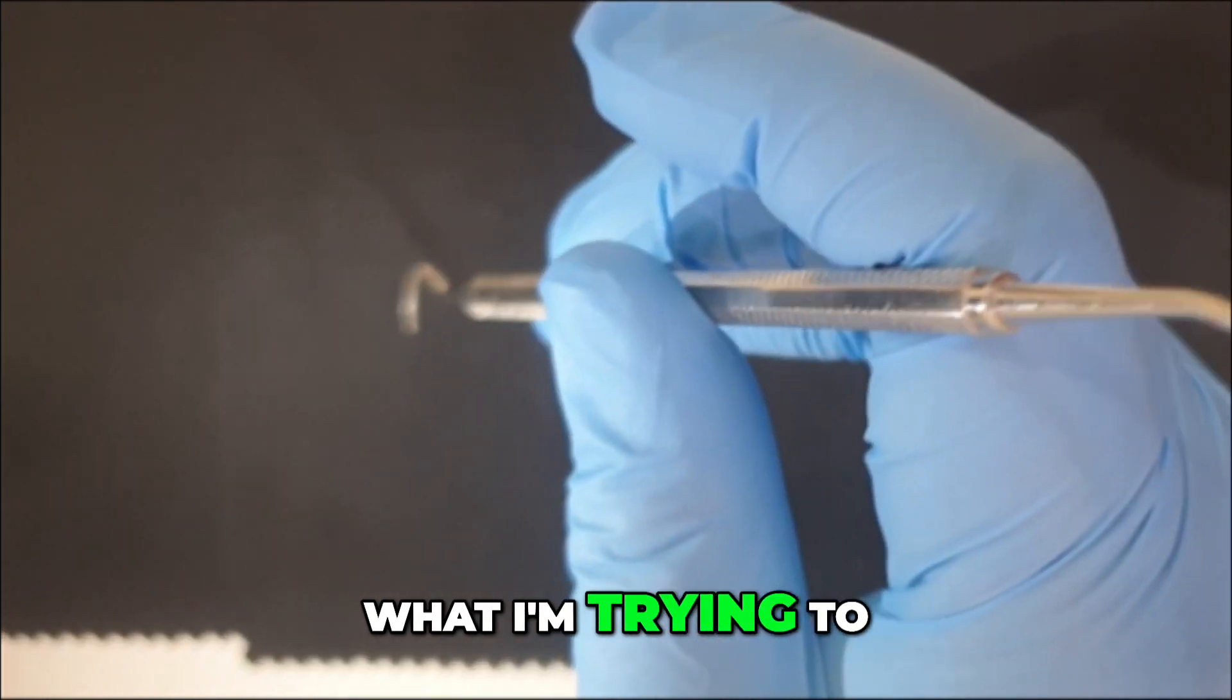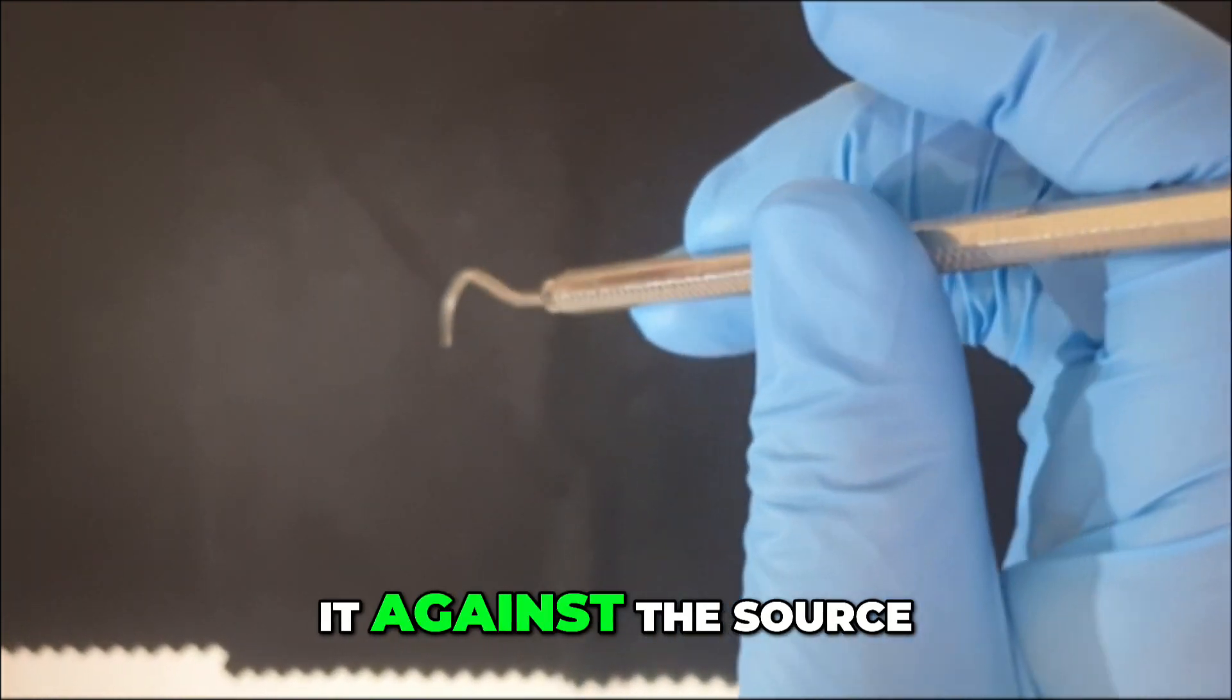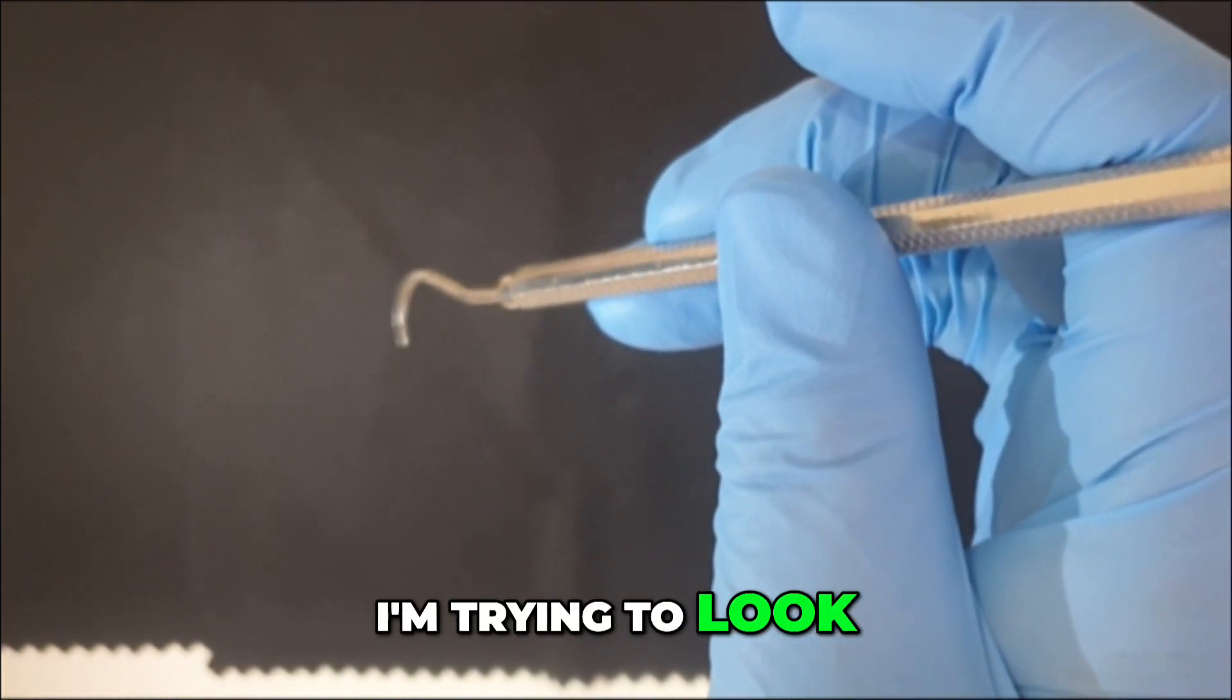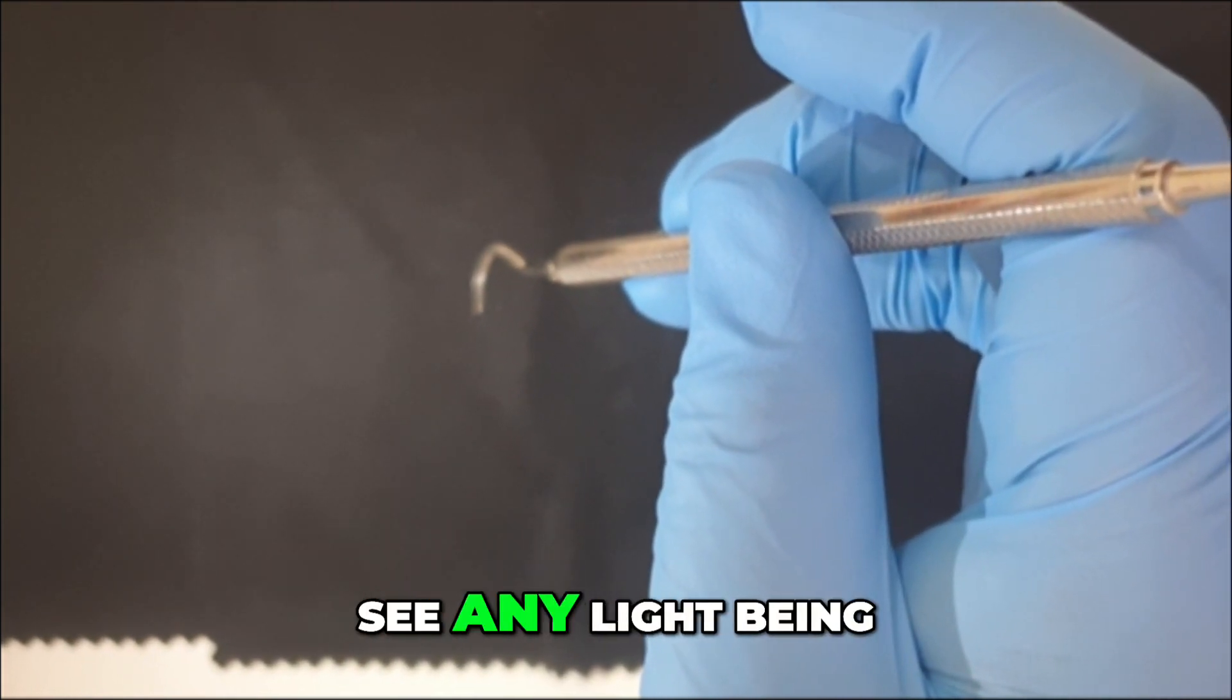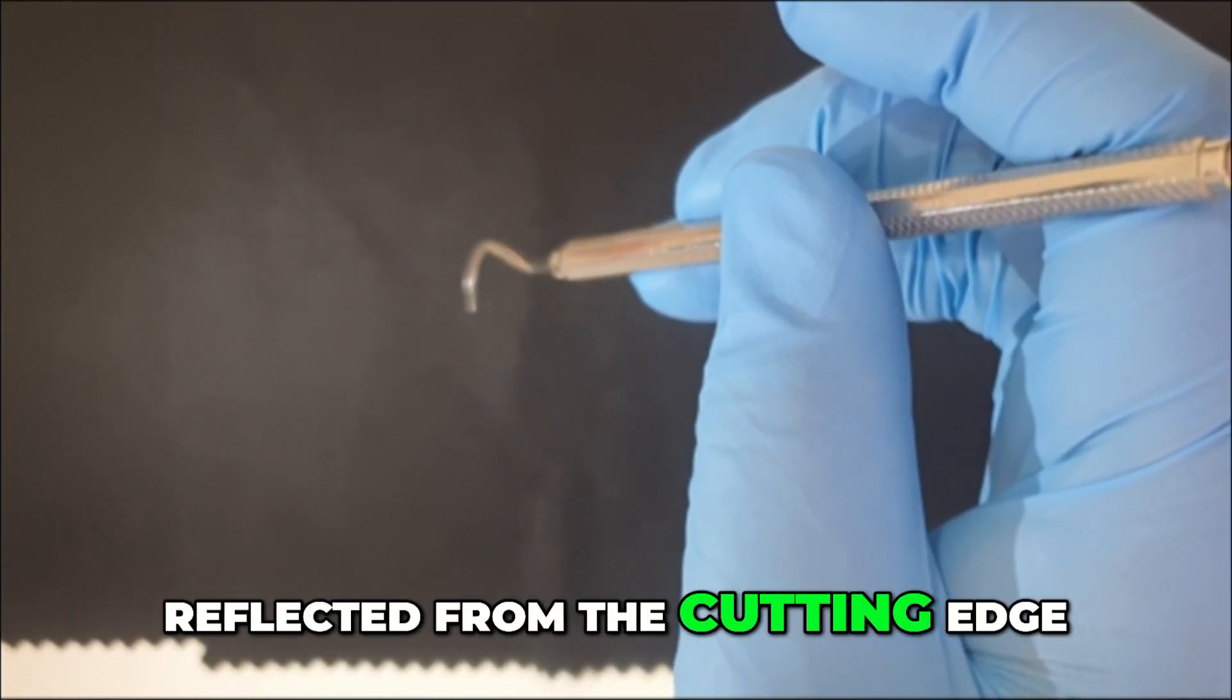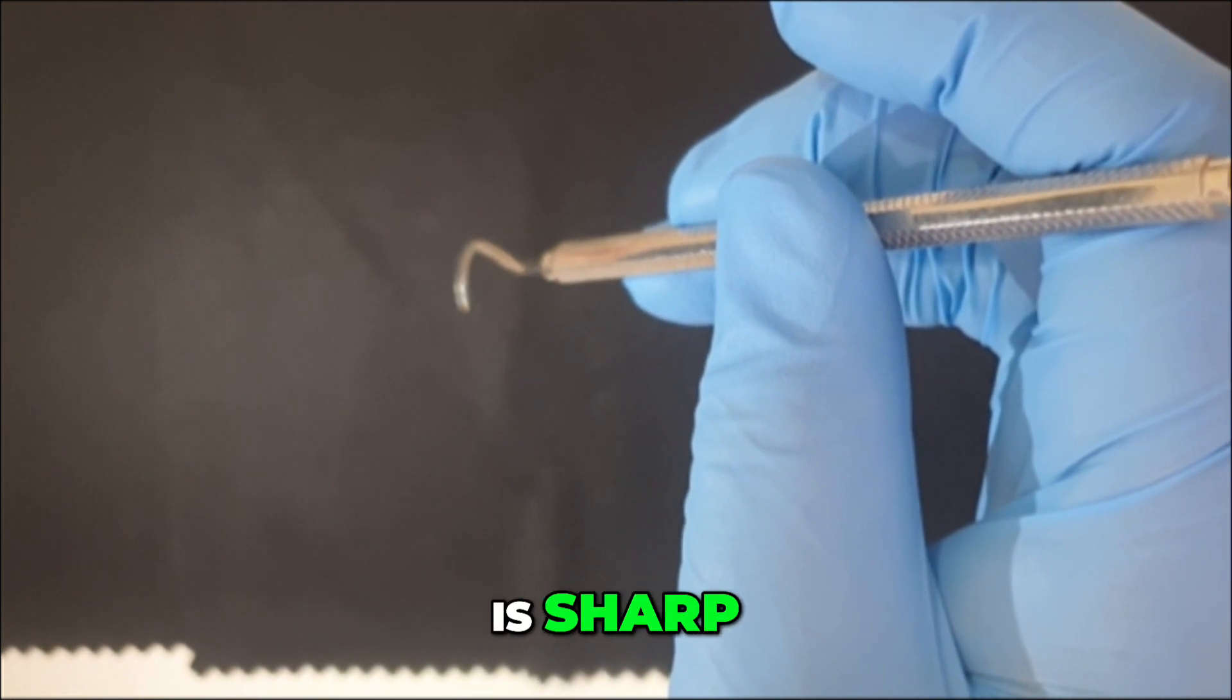Now what I am trying to do is, I am holding it against the source of light. I am trying to look at the cutting edge. I am not able to see any light being reflected from the cutting edge. That means my instrument is sharp.